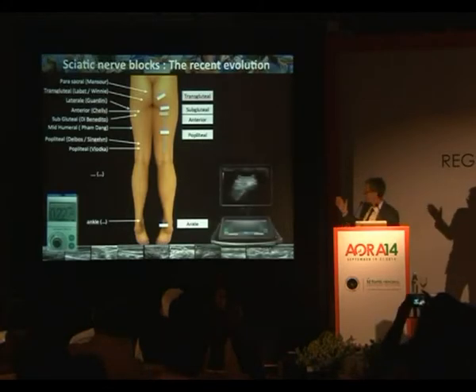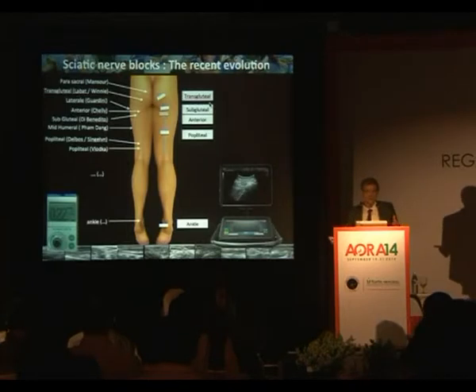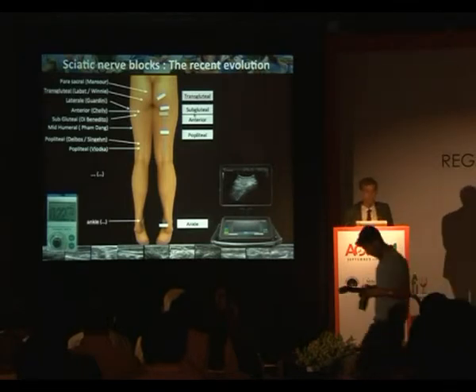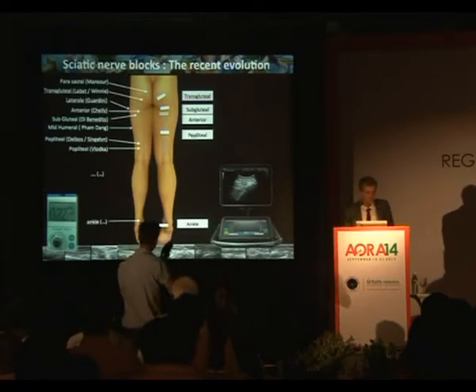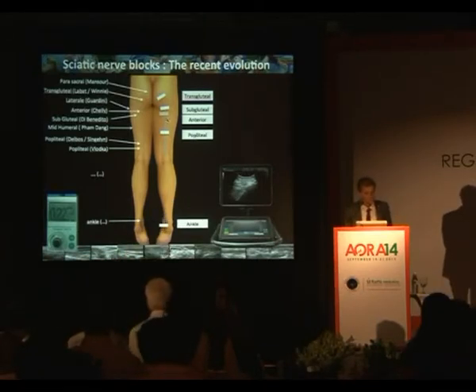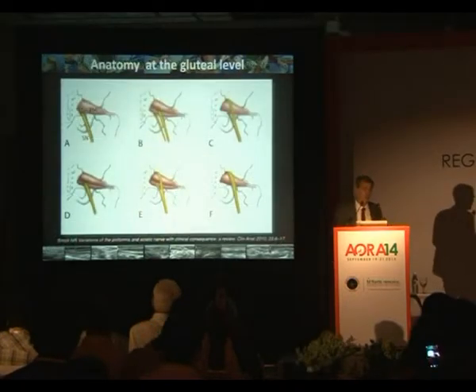We have these four approaches, mainly four. Ankle blocks for me are peripheral distal blocks. We have the transgluteal, and is there any difference between the transgluteal and the parasacral? Question mark, we have to prove it. The subgluteal is, I think, quite the equivalent of the popliteal. It's a very high popliteal. Of course, the anterior is totally different. And today I'm going to show you a very, very simple and very safe transgluteal approach.